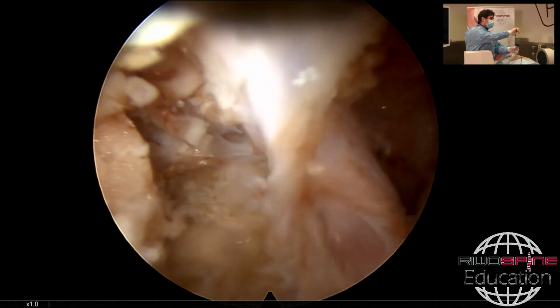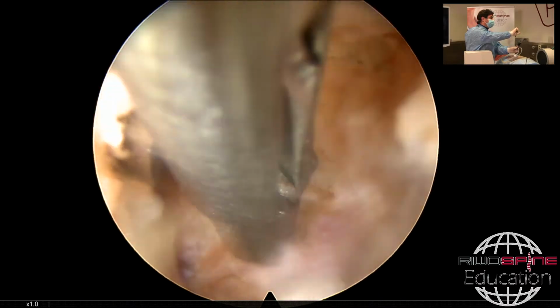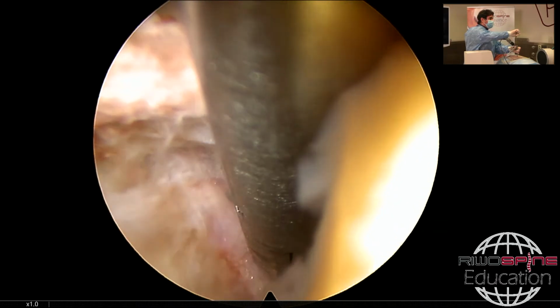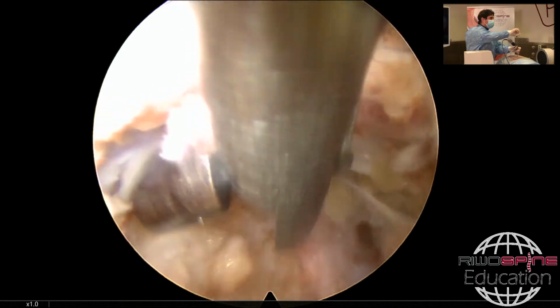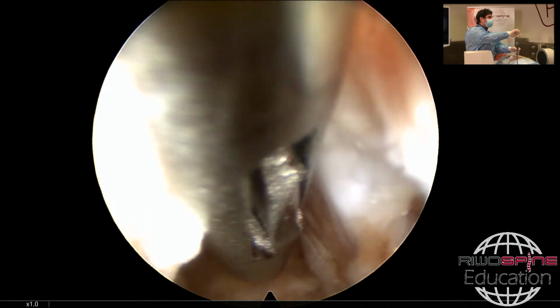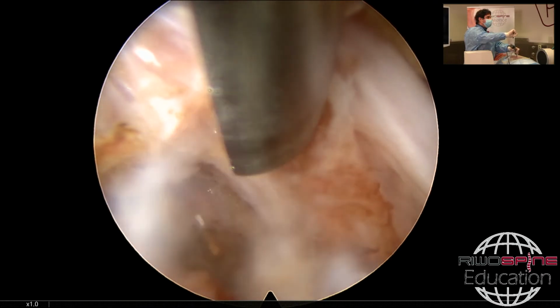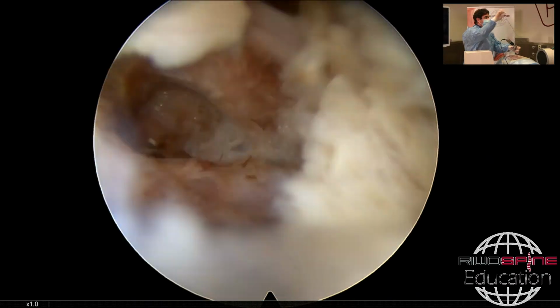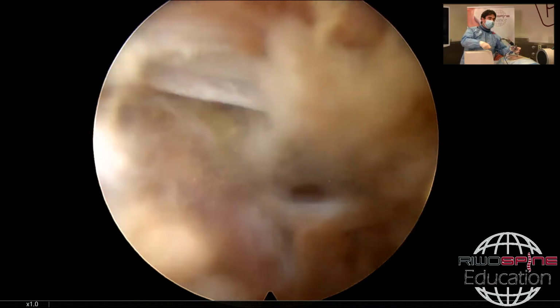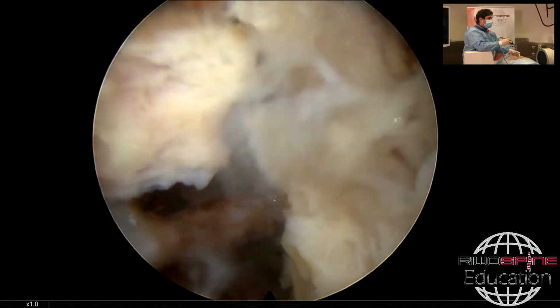And I would like to show you one more thing. Here you see the pedicle, and this space is here. Yeah, with the transforaminal approach, maybe you will reach here, but not more than here. That you can explore that side, also the axilla, like that. The reason for us to do the interlaminar approach to reach the far caudal migrated disc herniations is that.